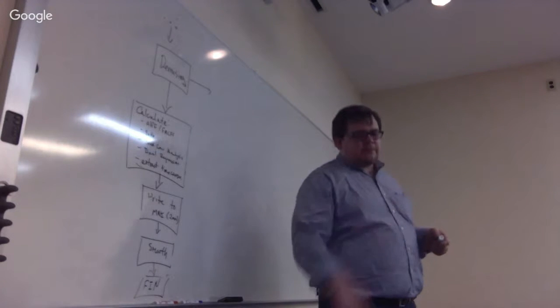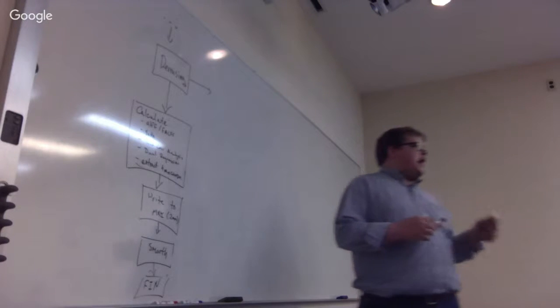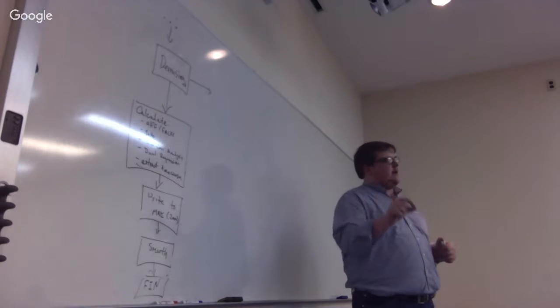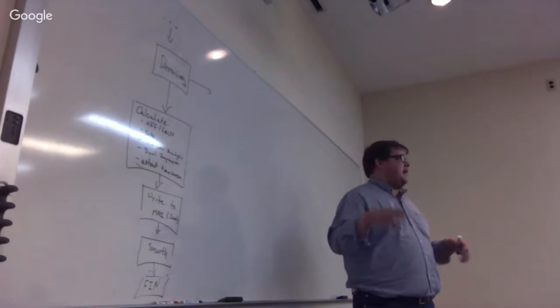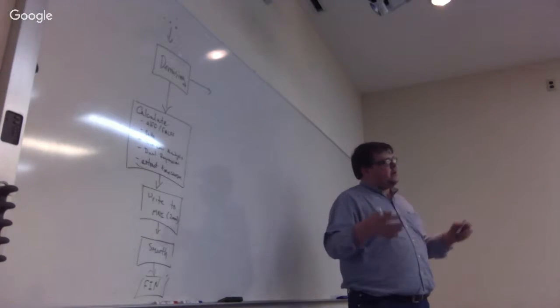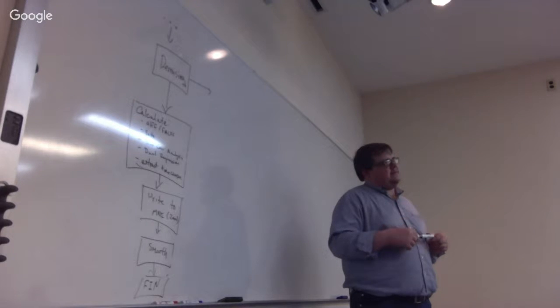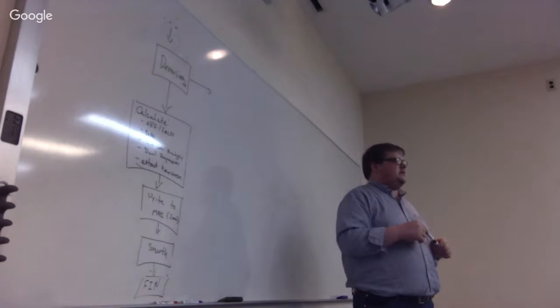Oh, so think about, how big does it get, right? Suppose you have data that is 3 by 3 by 3, acquired at that resolution. If you sample that to 1 millimeter space, you're increasing the size of the file by a factor of 27, right? You go to 2 by 2 by 2, you're increasing it by a factor of, well, 27 divided by 8, right? Because you're going from 3 by 3 by 3 to 2 by 2 by 2, right?